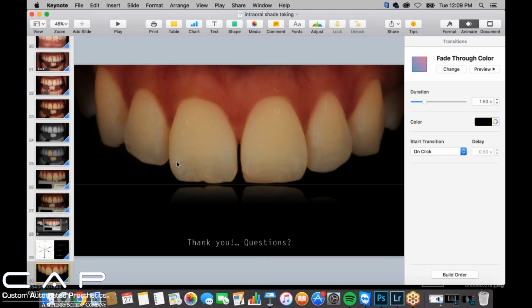They make a special one for Canon or Nikon. They do make it for ring flashes as well. You don't have to have a twin flash, and that works okay, but to get that uniform specular reflection photo and then polarized photo and have them both be the same, I think it's a good idea to get that twin flash.